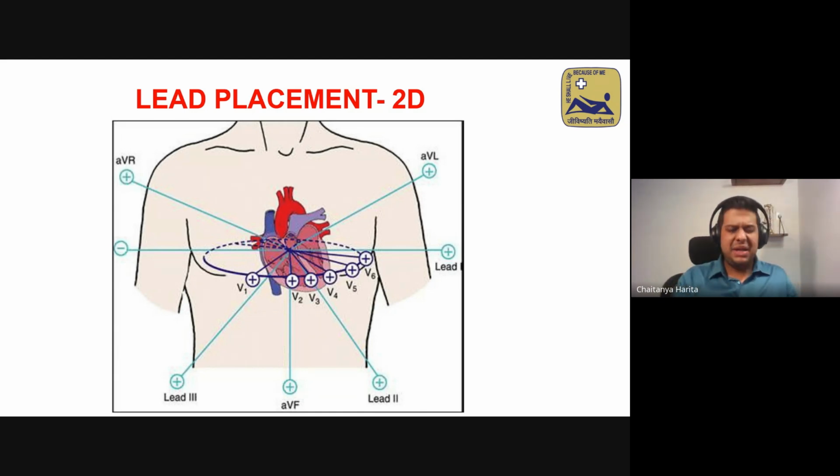Now, what do I mean by the cardiac vector? It is the net electrical impulse that goes from the SA node to the AV node to both ventricles. And all of you should remember that the cardiac vector generally goes from right to left, from right shoulder towards the left foot. The reason is the right atrium is towards the right shoulder. And in the ventricles, the left ventricle is 3 times the size of the right ventricle. So the net impulse is always towards the left.